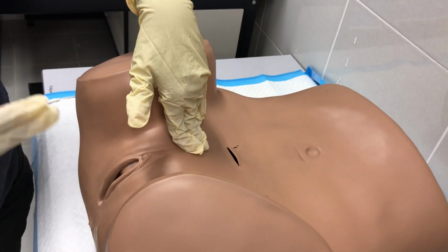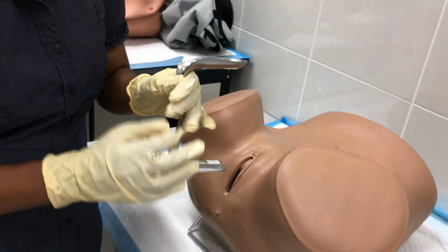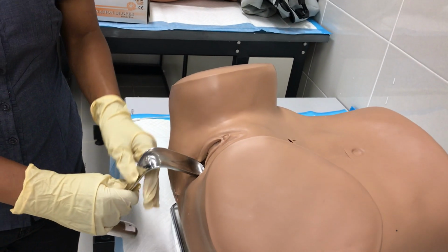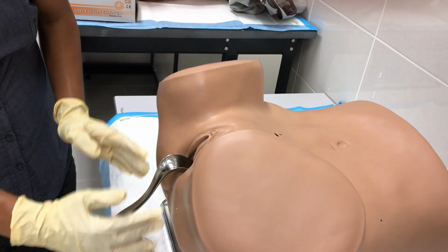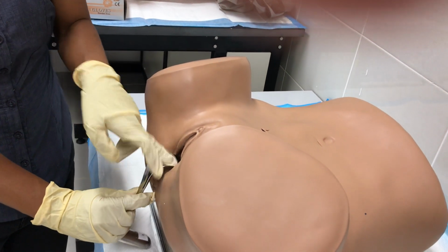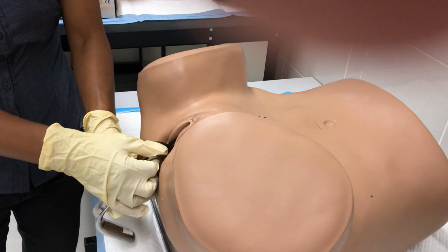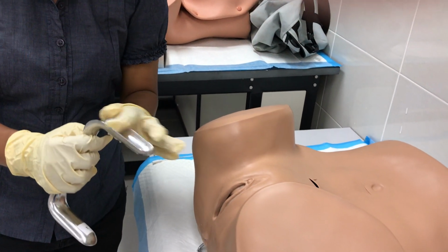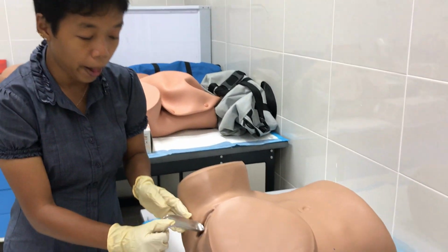After you finish, you need to use the Sims speculum. If you have an assistant, they can hold the Sims speculum. If you don't have an assistant, you can put it there and it will be nicely positioned at the patient's perineum. Then you apply lubricant, either chlorhexidine or warm normal saline or warm distilled water.